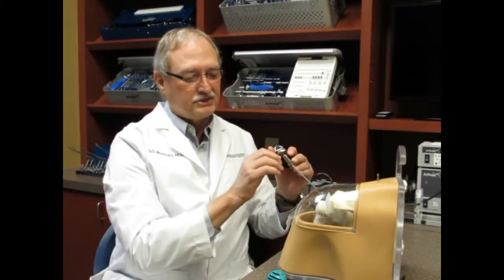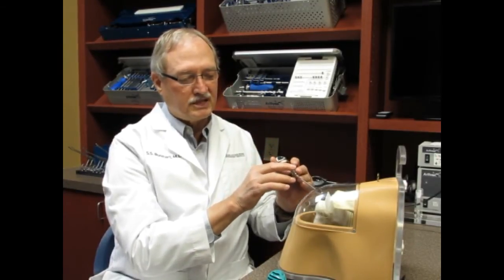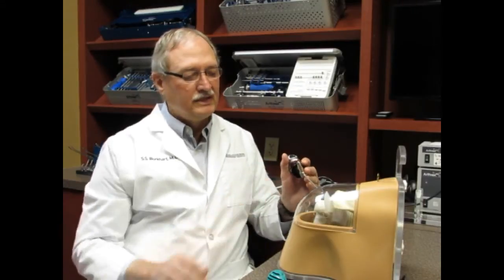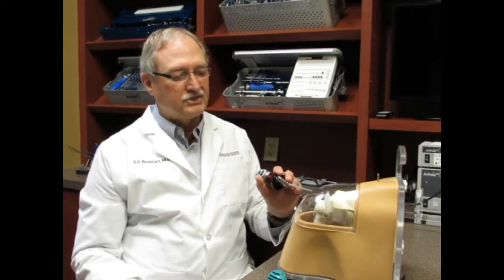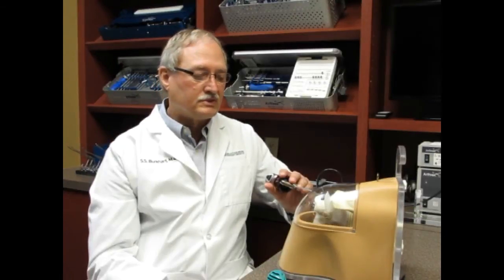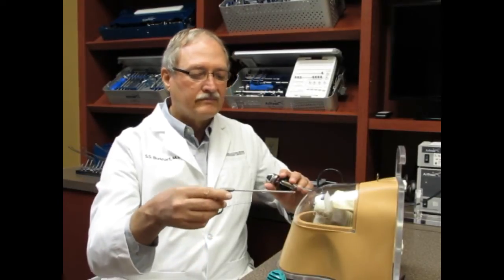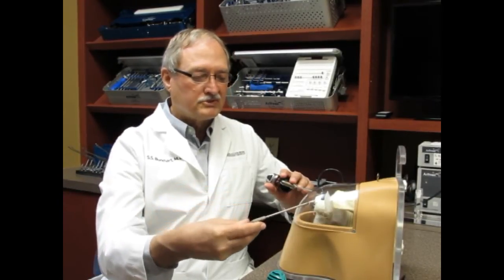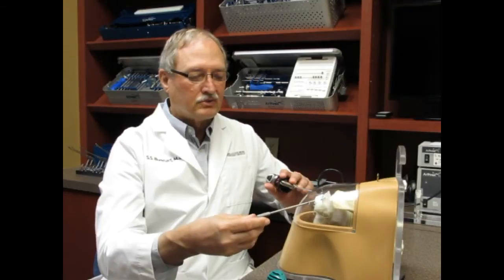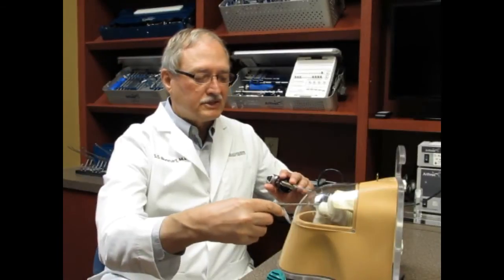You can actually put a scope in there just through a very small portal, just enough to get an instrument the size of a ballpoint pen into the shoulder, and then you can see everything in the shoulder. You've got no spatial constraints. Visualization is much better than it is with open surgery. And then we can bring other instruments through these other small portals that we make strategically to be able to reach the areas that we need, and we can pull these down.